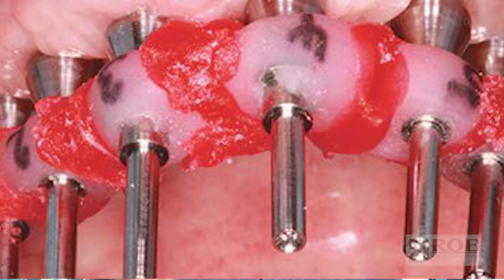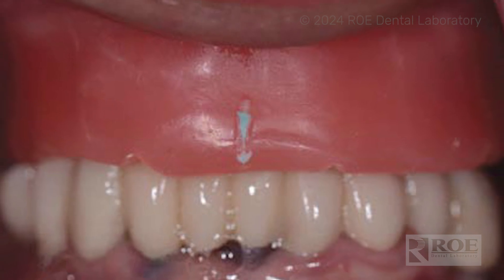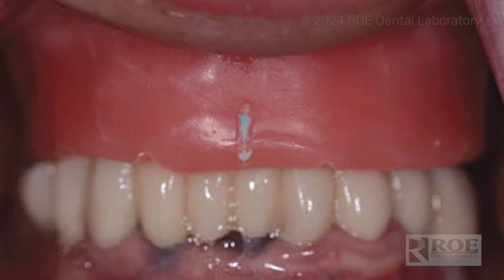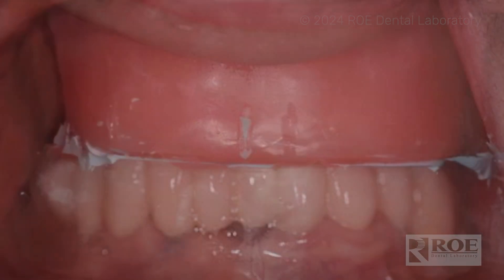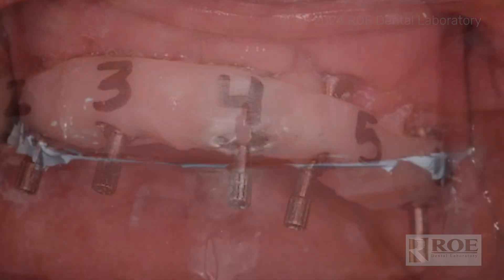The bite rim is your standard bite rim records — mark the midline, cuspid lines, high smile line — and then you're going to take a bite: some blue bite, a couple notches in the wax. Give us a bite. That's the easy part.